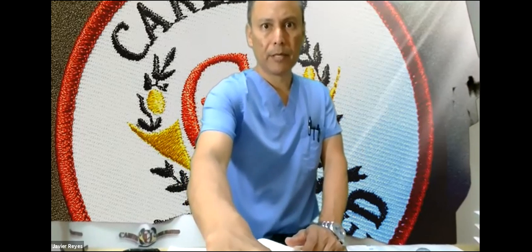So the prostate is right underneath the urethra, and when it gets bigger, the prostate enlarges. It puts pressure on the urethra, so urine can't come out. So what happens is that you will be unable to insert the catheter. It's going to be very difficult. So if I know that I have a patient that has this problem, I'm probably not going to ask you to do something like this, because it would be challenging for you, and you might actually hurt someone. I would not ask you to do something that I know you may not be able to do.